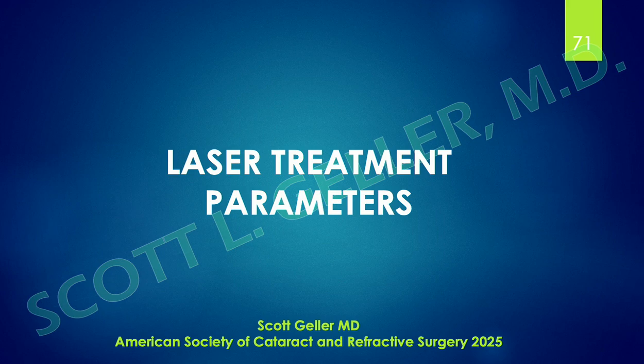I've also done laser on patients that have had a vitrectomy in one eye and had a complication like a retinal detachment or vitreous hemorrhage. Those things do happen, and you shouldn't gloss it over. Vitrectomy can be dangerous. There are patients also on anticoagulants or may have cardiac issues or other issues that make them very wary of undergoing traditional surgery.